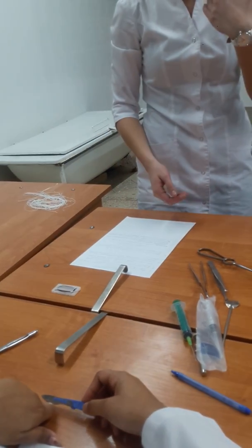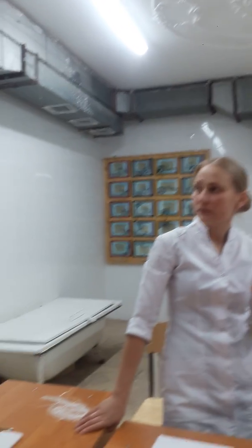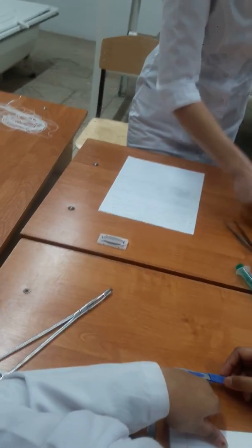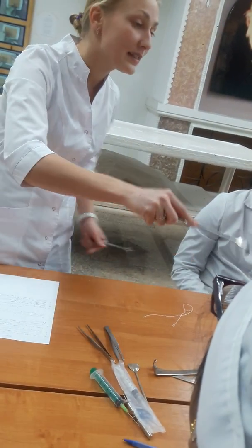I'm an assistant. My main goal is to help my surgeon. So if we use these hooks, you need to take them this way. Sometimes this way.